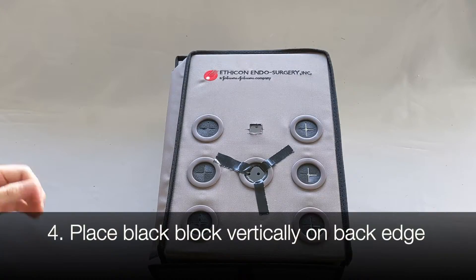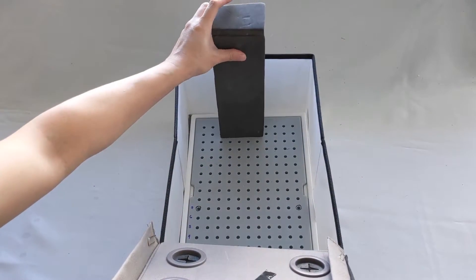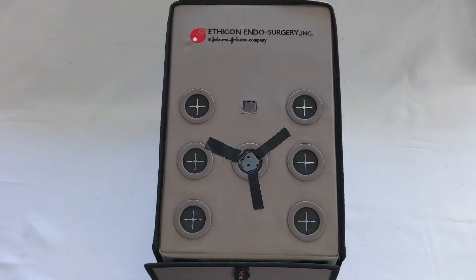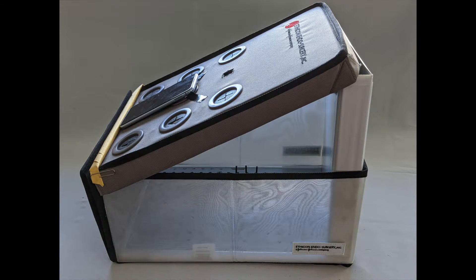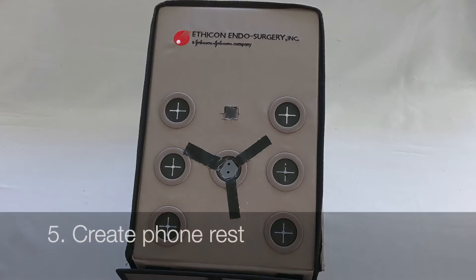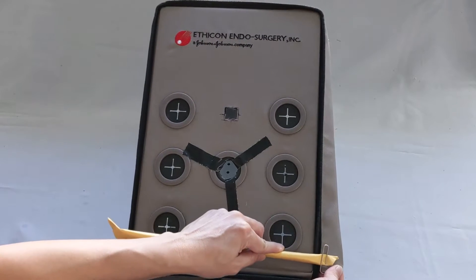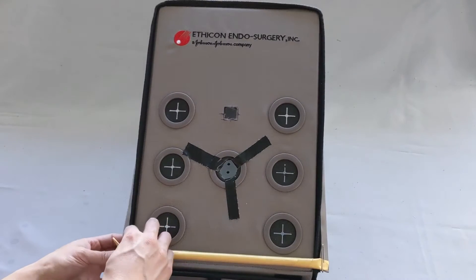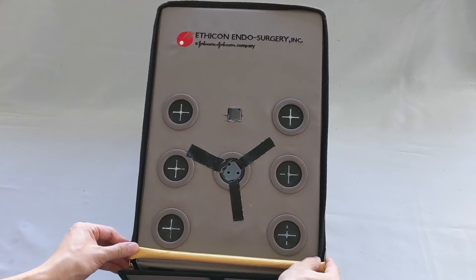Four, place the black block vertically at the center back edge of the box. Fold the cover over the block. This allows the cover to sit at an angle and provide the optimal triangulation for the instruments. Alternatively, you can use a book or binder to hold up the cover — the height here should be approximately 12 inches. Five, create a phone rest by either using a rolled-up piece of paper, or you may also use a pen or marker and tape it to the edge of the box. This will prevent the phone from sliding.